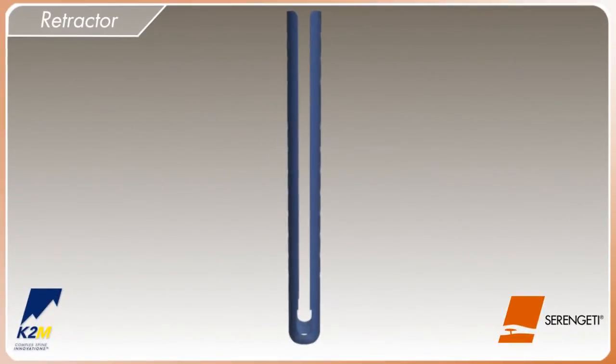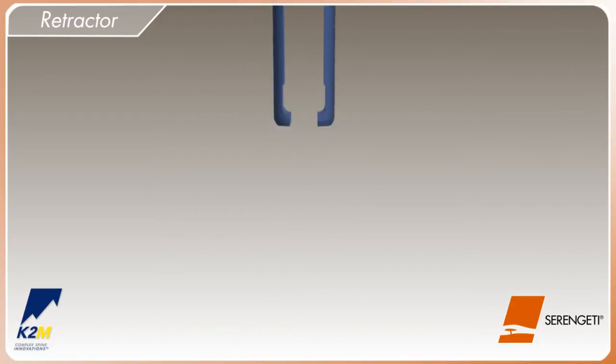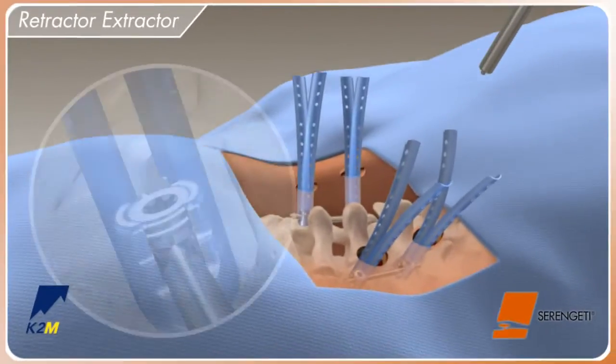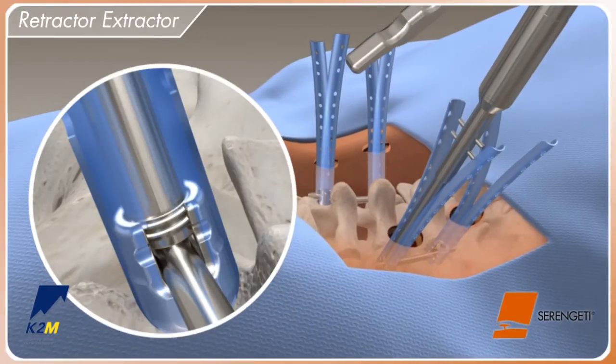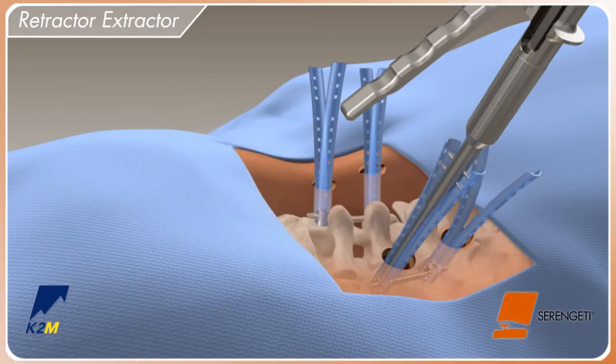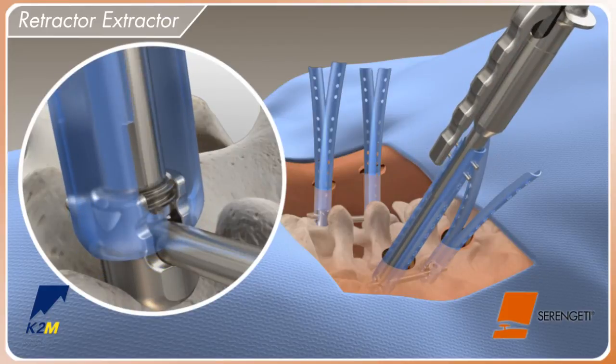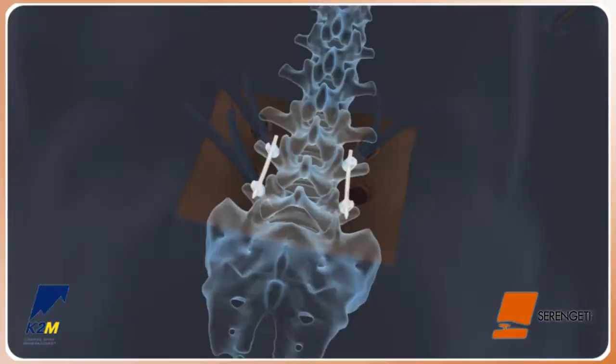The Serengeti retractor is designed with breakaway features for easy removal after locking the construct. Position the retractor extractor onto the Serengeti retractor, ensuring the locating pin is securely placed into the screw. Engage the top two holes of the Serengeti retractor to the pins on the shaft of the retractor extractor. A rapid closing of the handle will separate the Serengeti retractor at the breakaway features.